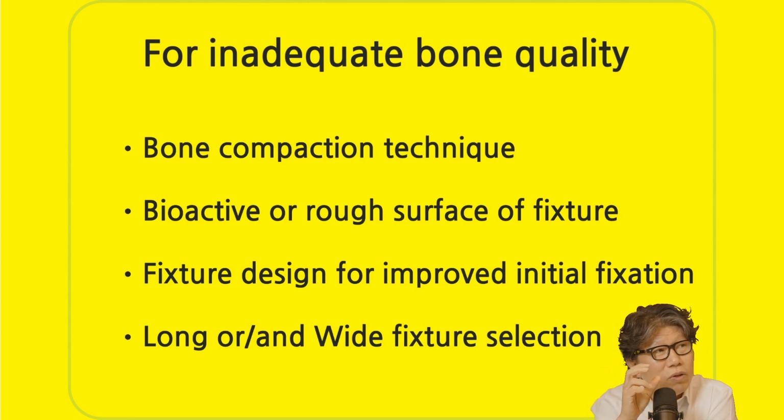Number 6 is the hard one. Maxillary 6 is hard because I use a lot of palatal anchorage. So that's a little bit difficult, but there's a lot of wide sinus. You have to think about that. So today, I planted an 8 millimeter diameter fixture in maxilla 6.